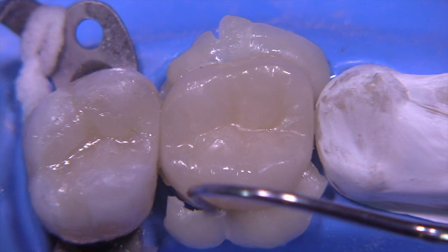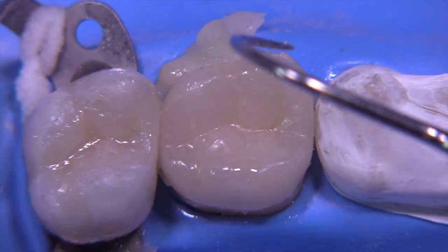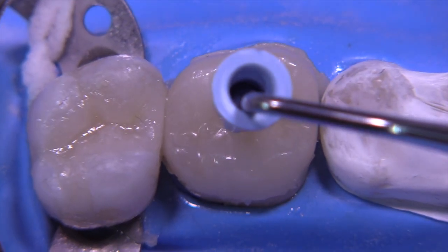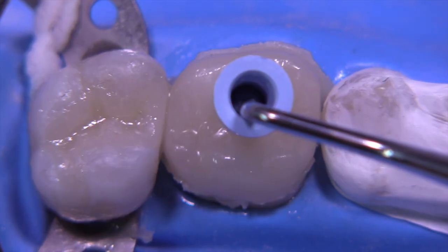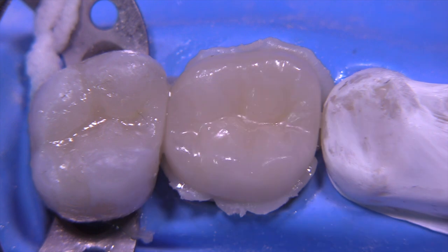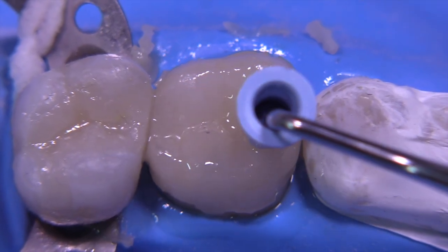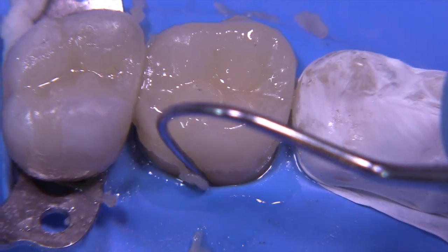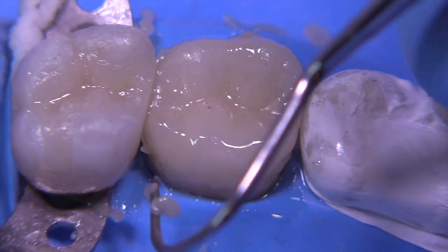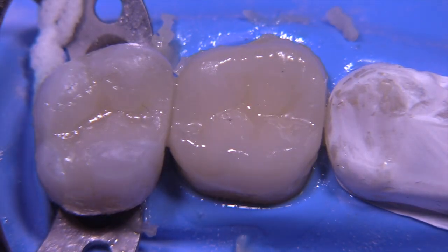Don't give up — just keep pushing. You'll think you've got it completely seated, but then you cleave off the cement and it comes off so clean. It's a nice way to work with bonded ceramics because you have very little cleanup. Watch the composite ooze out — you really have to put your shoulder into it. Get the restoration seated all the way. When no more material is coming out from the interface between the restoration and the tooth, you're ready to stop, clean up the edges, and apply unfilled or modeling resin to smooth that transition — much like a Class 5 restoration — so you have a seamless connection between ceramic and tooth structure.